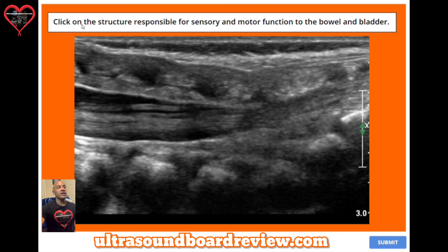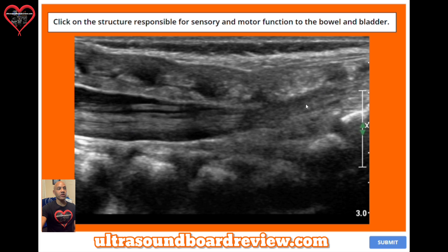Question 40. Click on the structure responsible for sensory and motor function to the bowel and bladder. The answer is the cauda equina right here.